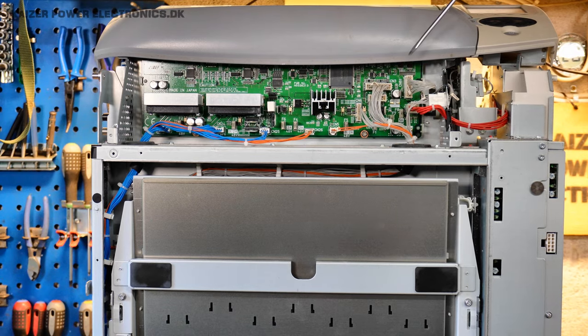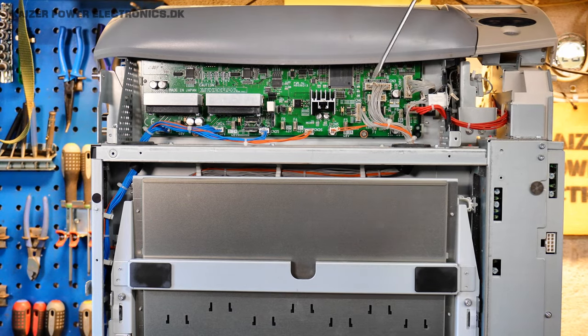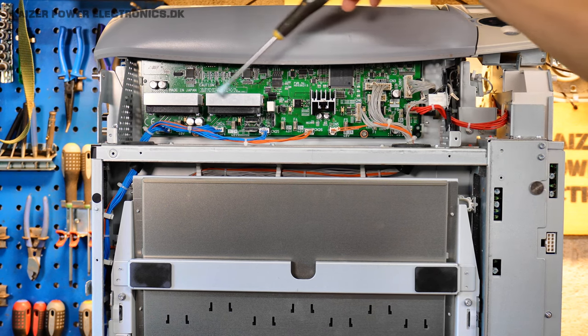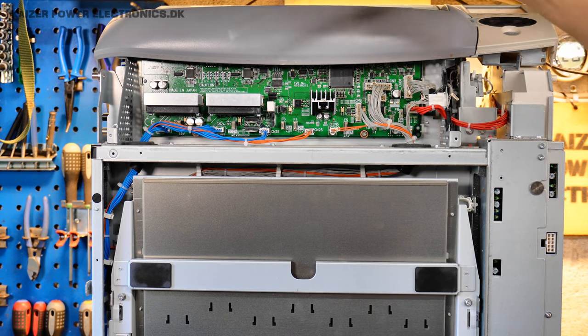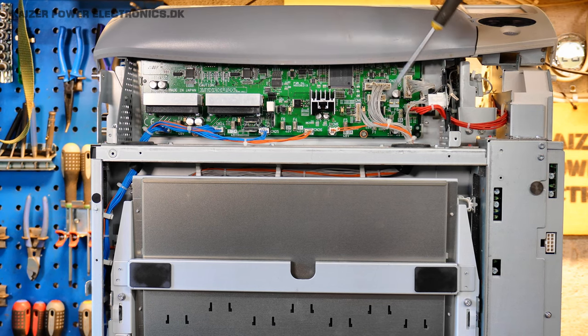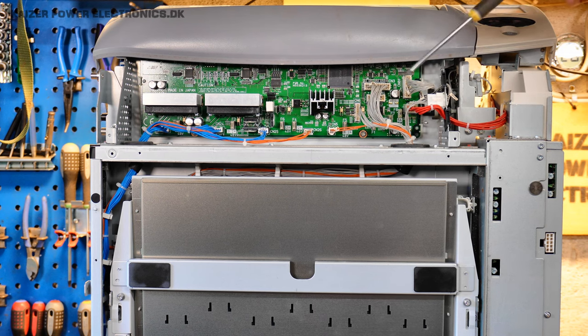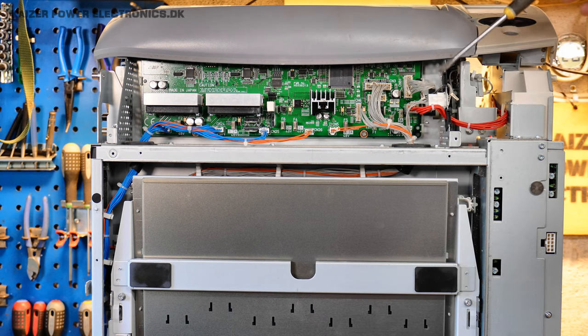At the front of the unit we have another servo driver board with the same Altera Flex FPGA, two stepper motor drivers, a lot of smaller components — probably including some sensory inputs — and also some smaller motors, photodiodes, and small pumps for vacuum.